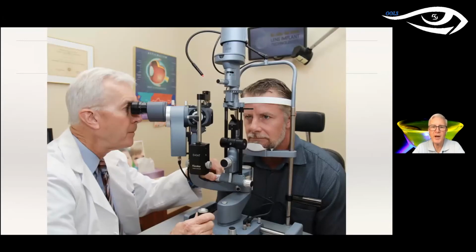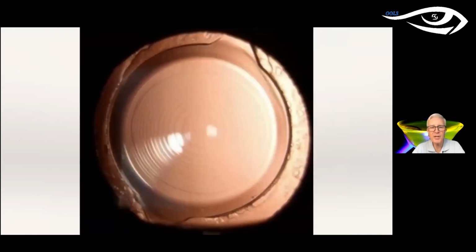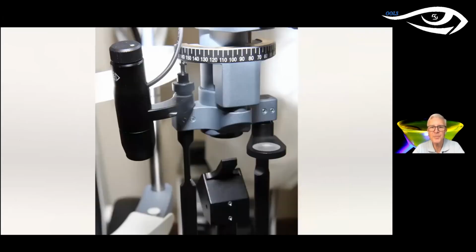So here you see now the light source is right in front of our patient here, who happens to be my lab manager. And now the oculars are over to one side, and that's how you flip it. You just reverse it. So it makes it pretty easy. Take some pretty good pictures like this: Symphony multifocal IOL with retroillumination. I think it's a pretty interesting picture.